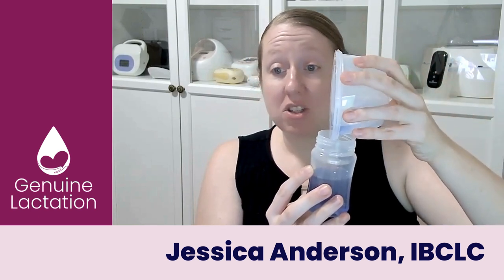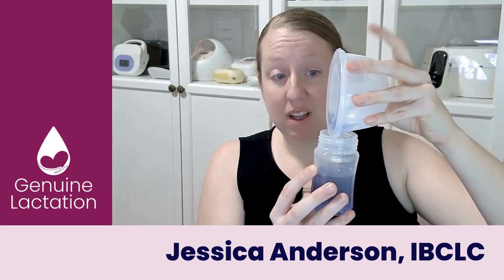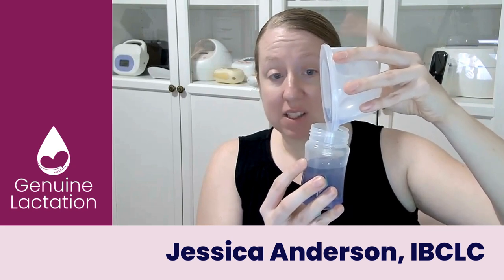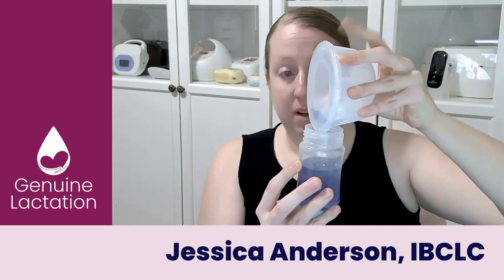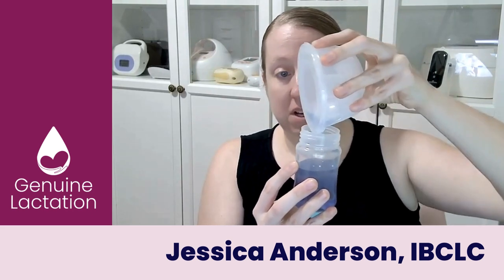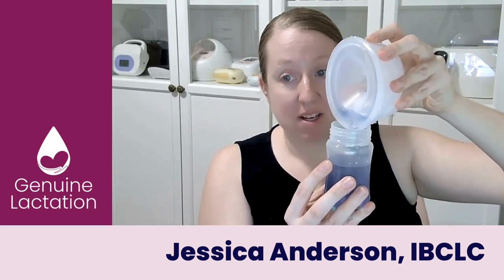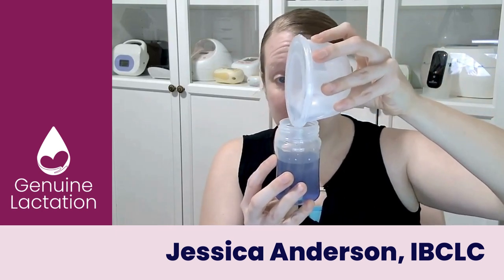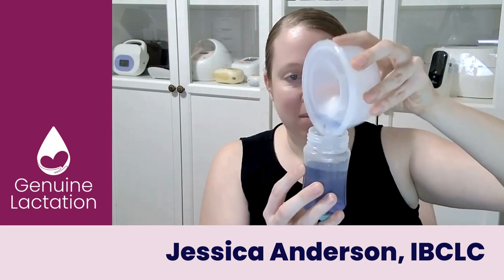Do not shake it to get that last liquid out. What you're going to do is take your finger and tap. Because your bottle is sitting secure on this, nothing's loose. You're just going to rock it back and forth just a little bit and tap to get the remaining liquid out. You can tap it ever so slightly, but you don't want to come more than maybe a quarter inch away from that.